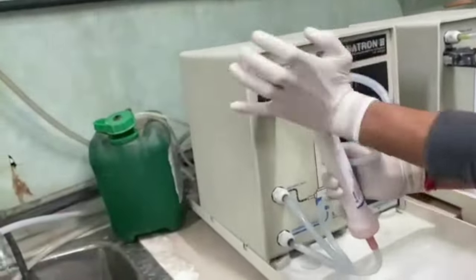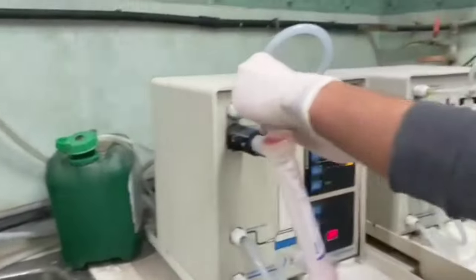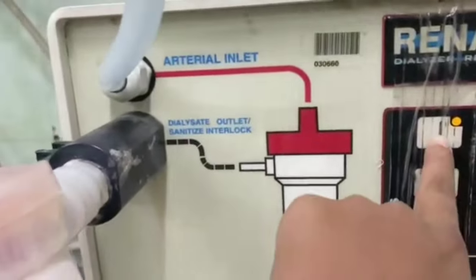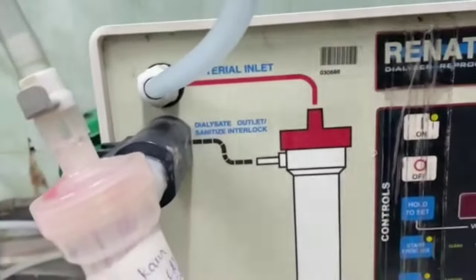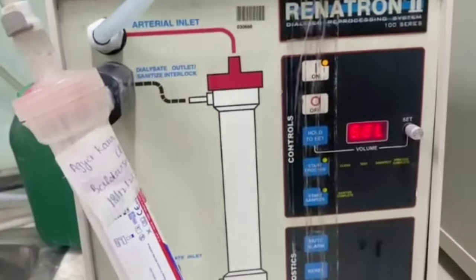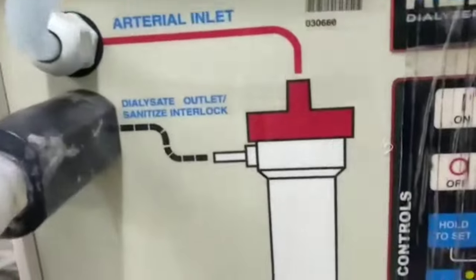After connecting your outlet to the dialyzer, look at the buttons — on top is your ON button. Now, the first thing you need to do is turn it on.